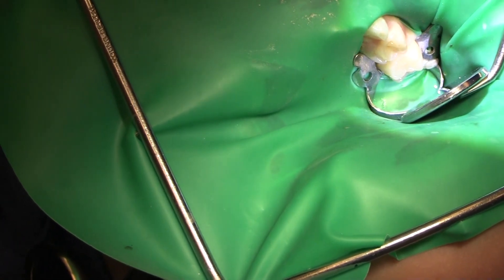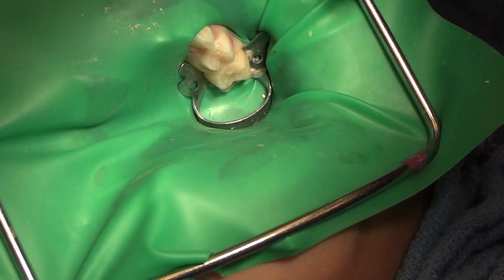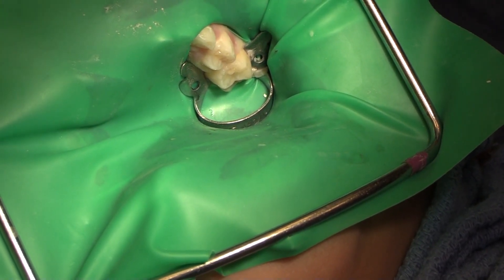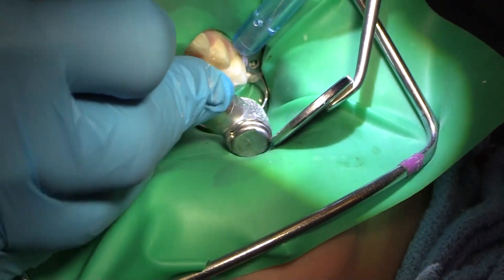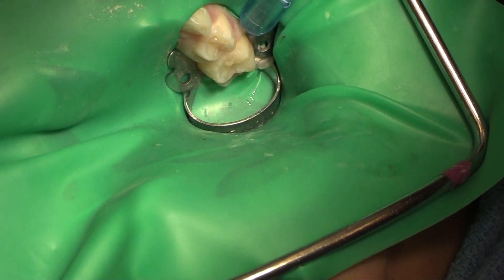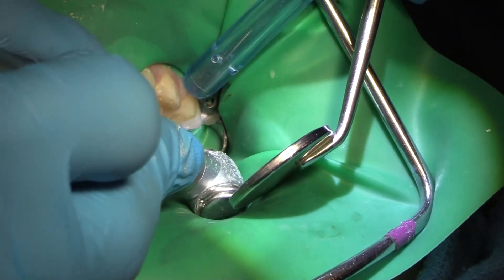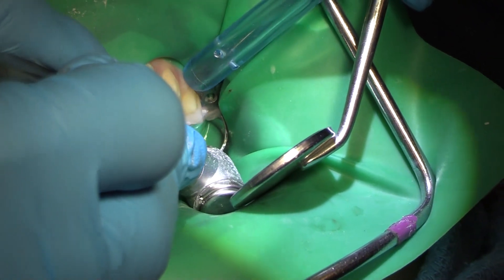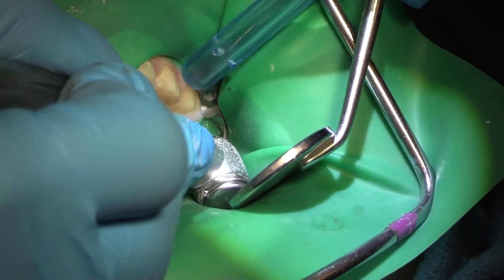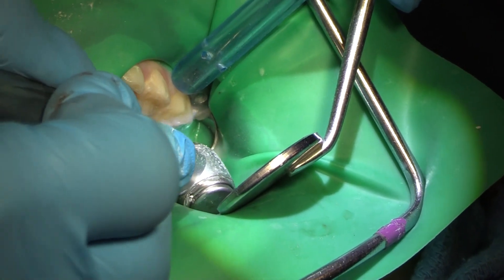This tooth is going to have an MO on the last molar, a crown, and then a distal on the cuspid. I'm going to go in and cut that — there's a fairly large decay on the distal aspect of this molar. I'll go in there first; if it gets too deep and composite won't do it, I'll change the plan and do a crown, but let's clean it out and see where we're going first.